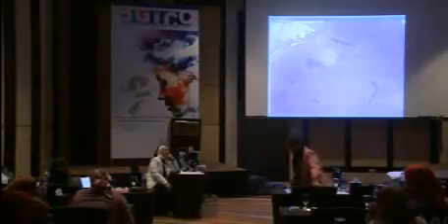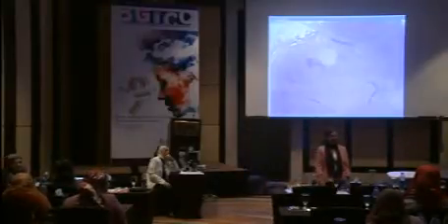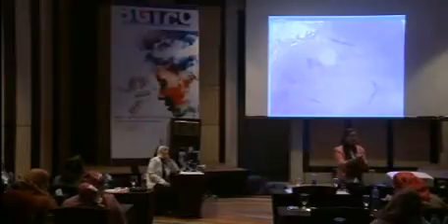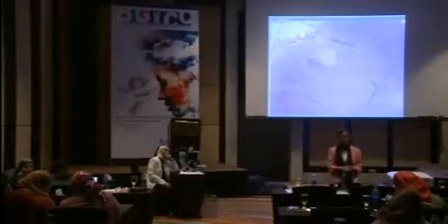I want to ask you about fine needle aspiration in the United States. If you need to do fine needle aspiration for a certain lesion, can you do it perfectly? Sure. Certain markers, for example ER and PR, work perfectly, but HER2 immuno cannot be done, but we utilize FNA for FISH. It works beautifully, especially for follow-up of the patient in the recurrent and metastatic disease. Yes, in the era of tumor heterogeneity. Yes, and this is the era nowadays. Correct.